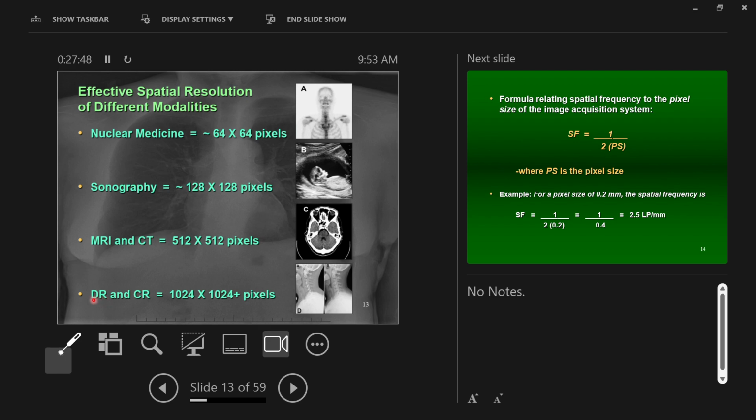DR stands for direct radiography. It does not stand for digital radiography. Okay, you just have to work with that. I know there's something called digital radiography, right? We don't ever abbreviate it DR though. DR is a special technical abbreviation standing for direct radiography. It's a special type of digital radiography, where we don't have a cassette, or if we do have a cassette, an image receptor, it doesn't have to be moved around, right? It is the type where you shoot an image, don't move the cassette, and the image is displayed on the screen for you without anything being moved between those two things.